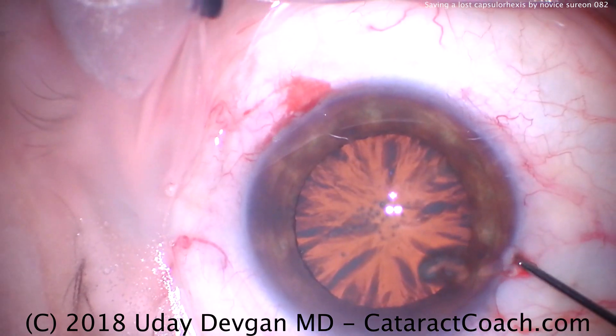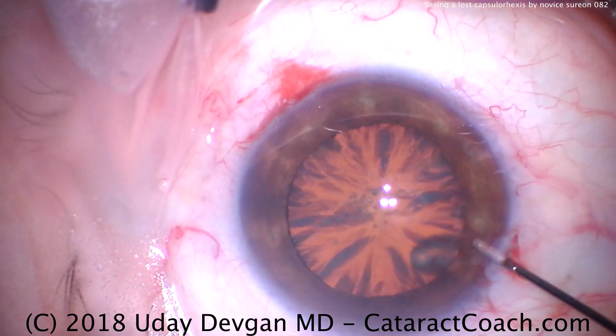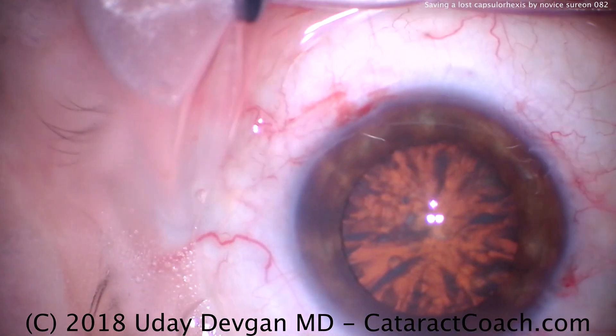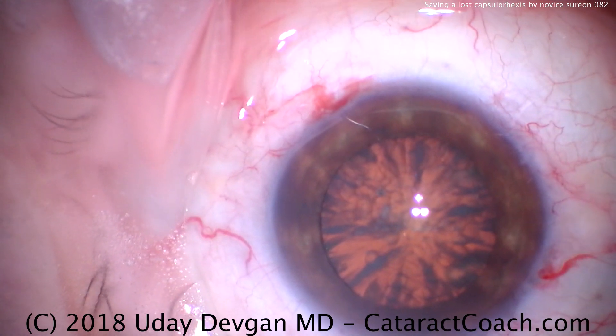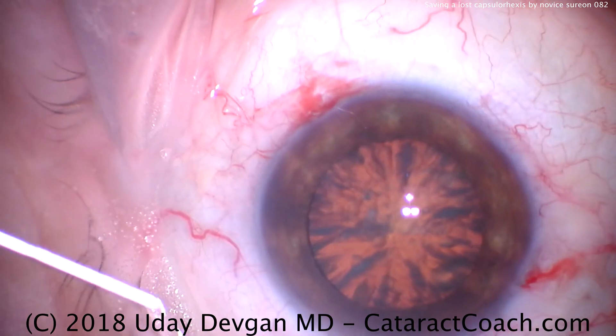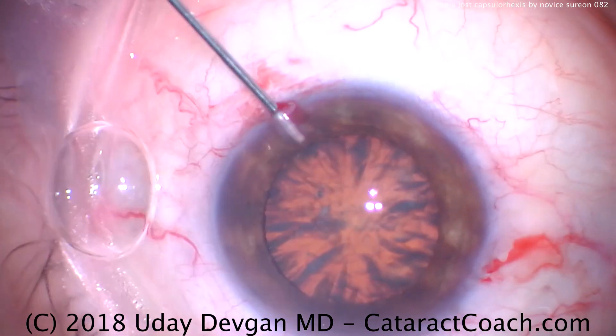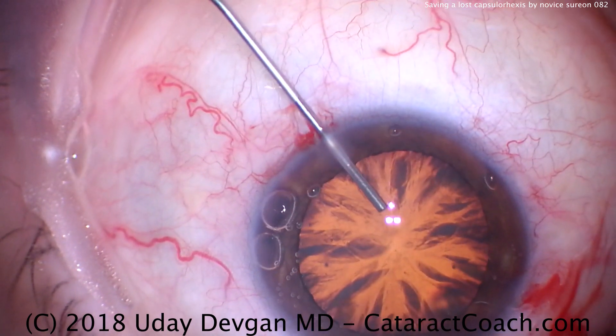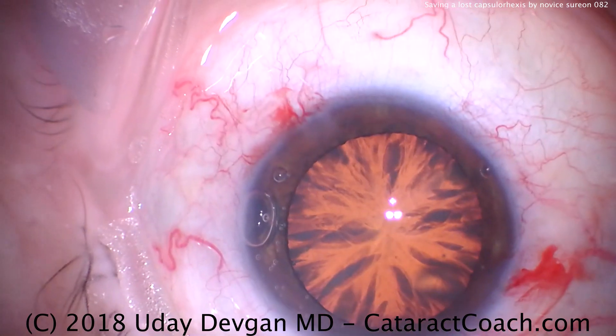Now here's the resident attempting to fill the eye with viscoelastic. A little bit goes in there, but that's just not going to be sufficient. Let me take the syringe and show that we want to have a good fill of the anterior chamber. I want that dispersed viscoelastic to coat the endothelium — that is much better.